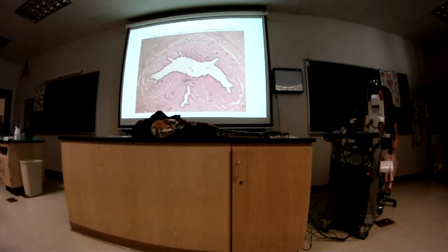So the opening is called the spongy urethra? Yes, the opening. Yeah, the urethra is the passageway. Okay, let's move on then.